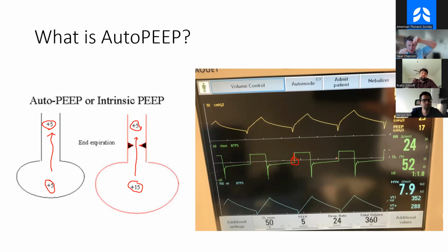It's going to start to crush that, and you're going to develop decreased venous return. Next alarm you start to hear is the low blood pressure alarm, and then the code alarm as this patient just expands. Or if they have a pneumothorax, you're going to end up with the tension pneumothorax and hypoxia and low blood pressure. So this is a pretty problematic thing.